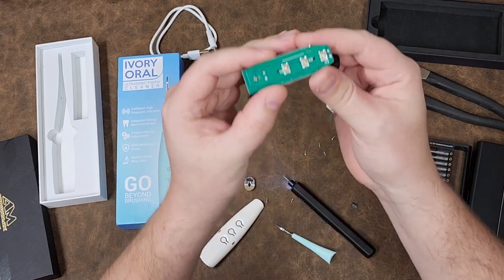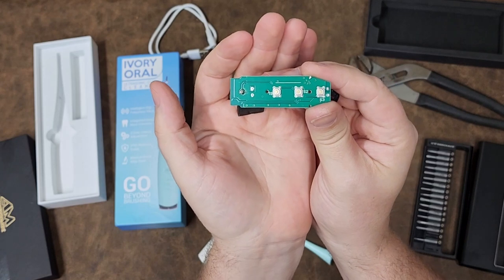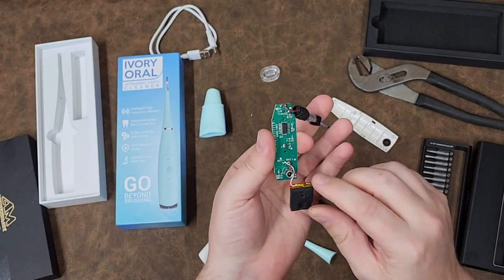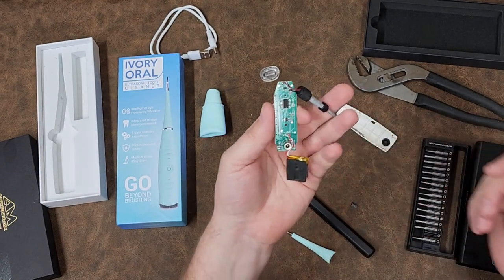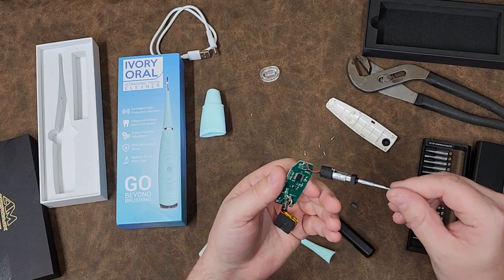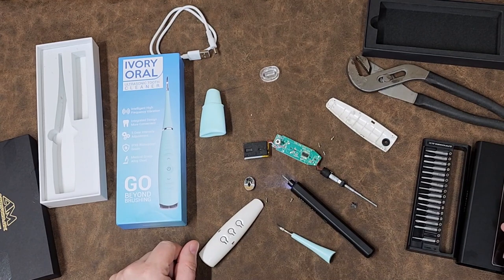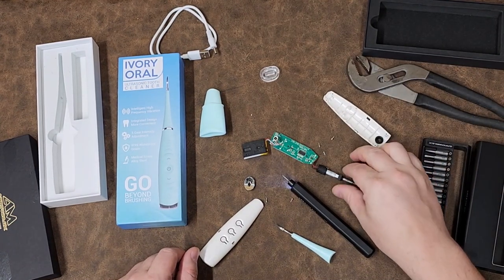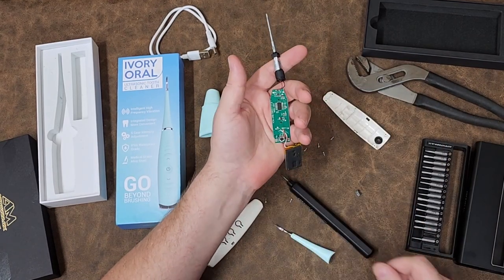There we go — some surface mount buttons on the other side. Very simple, very easy, cheap to produce. It's funny because the most expensive component on here I think is going to be that barrel connector. Manufactured to cost, and definitely completely different than an ultrasonic prophylaxis. Do not ever get these things — it is a complete gimmick.